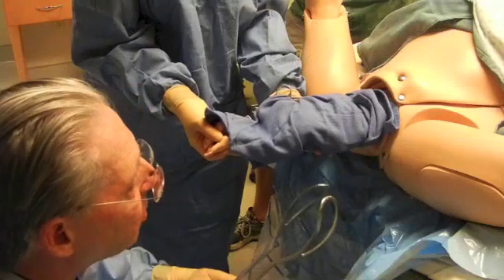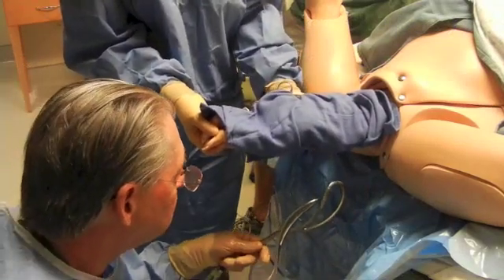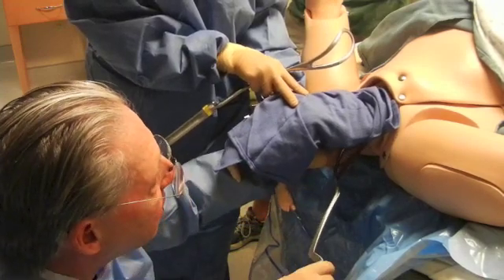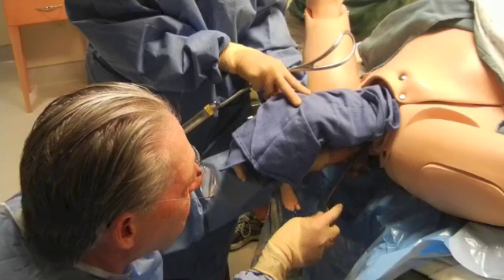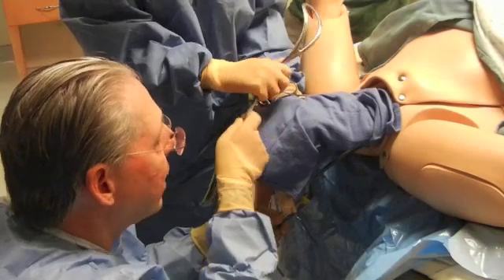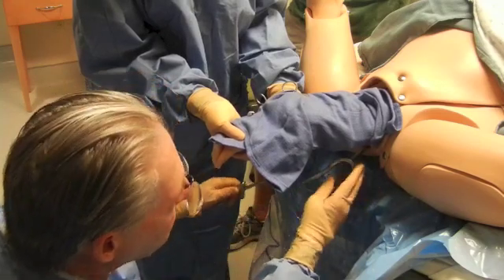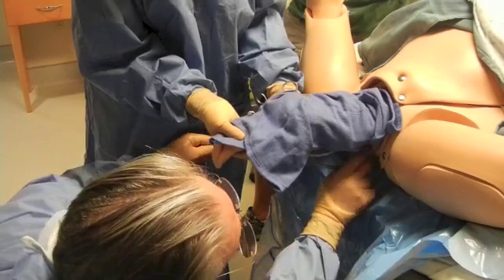The forceps are first applied with a phantom application. Since these are applied from below, it is best to be in a kneeling position. There is always a space between the head and the shoulder, so the blades go up and in. As a pelvic application, you are not trying to apply these directly to the cheeks — from below and up.